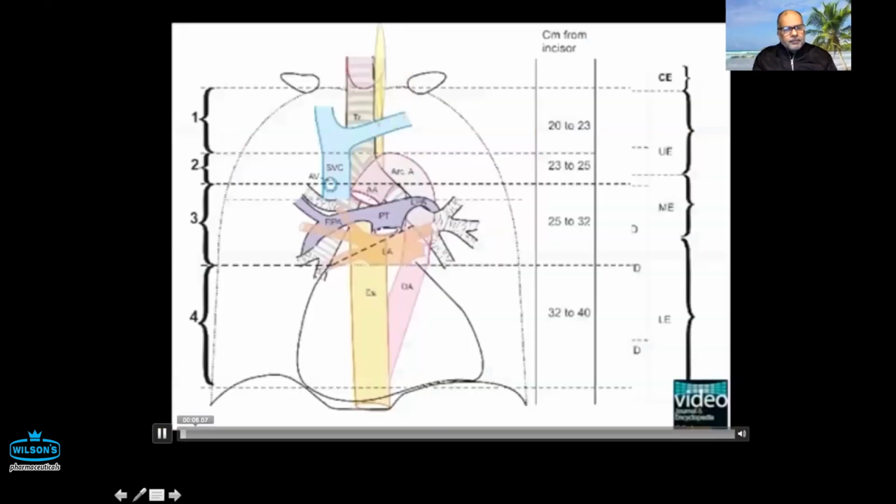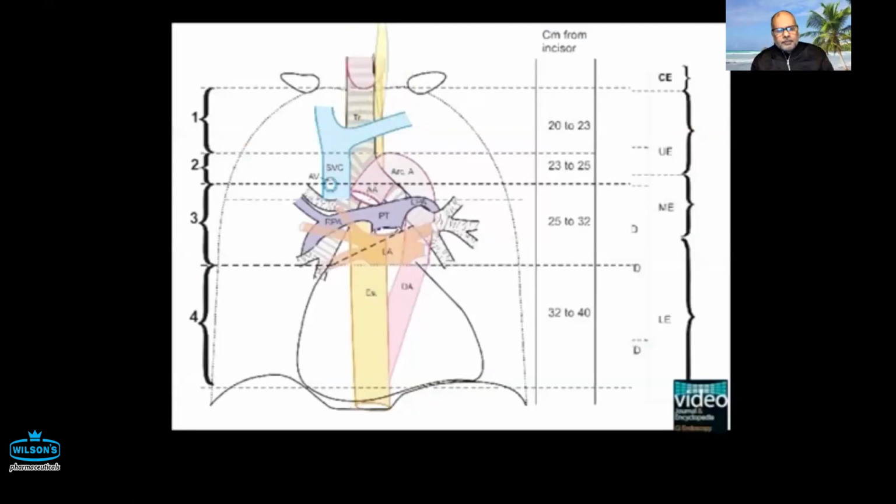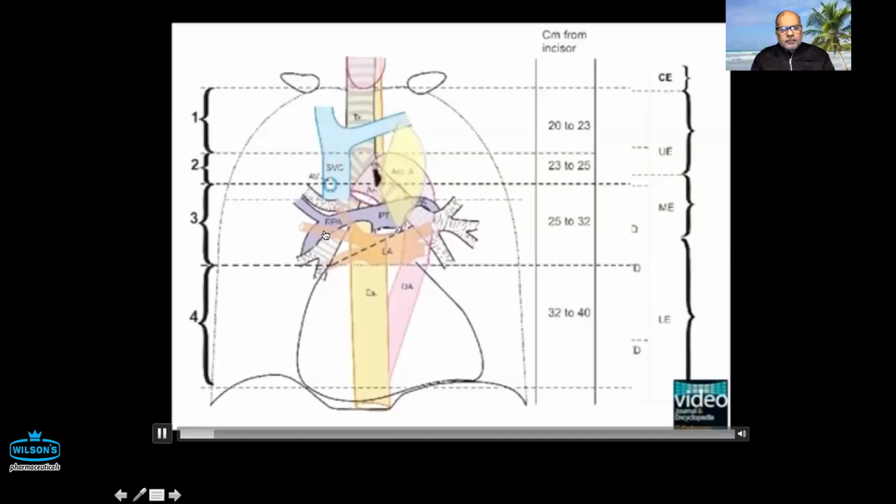Mediastinum can be examined from 4 different positions. Pushing in or pulling out changes the position. At each position, a home base is identified, and the scope is rotated by 180 degrees to 360 degrees. In this figure, the respiratory tract is shown in white with stripes. Other structures shown are, in blue, superior vena cava with azygos vein, in pink, ascending aorta, aortic arch, and descending aorta, in deep blue, main pulmonary and its branches, and in light orange, left atrium and the pulmonary veins.